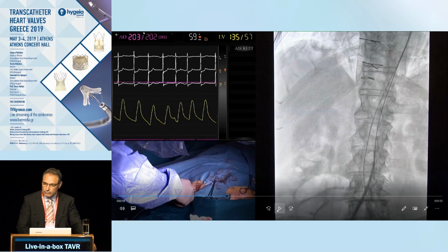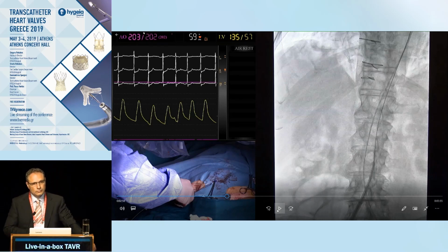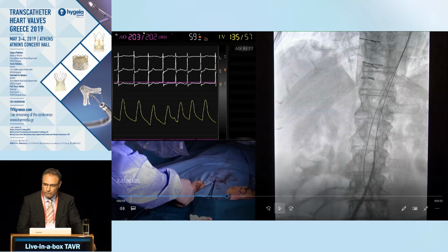Okay, because in the other cases it is easier to find the left carotid from the ascending aorta, so we don't manipulate it at the ostium of the innominate, essentially. Yeah, I understand, but that's what I'm saying, I just want to make clear for whoever is watching that this may be particularly helpful here, but is not the general way that this device is used.